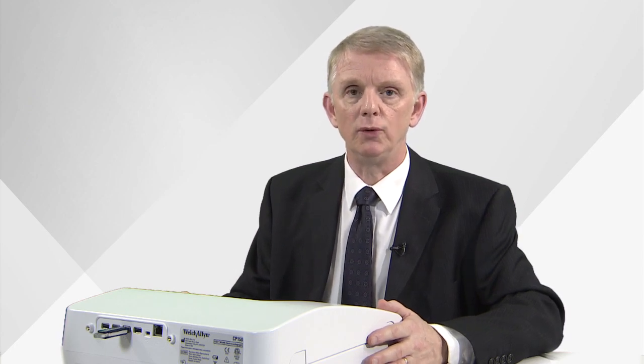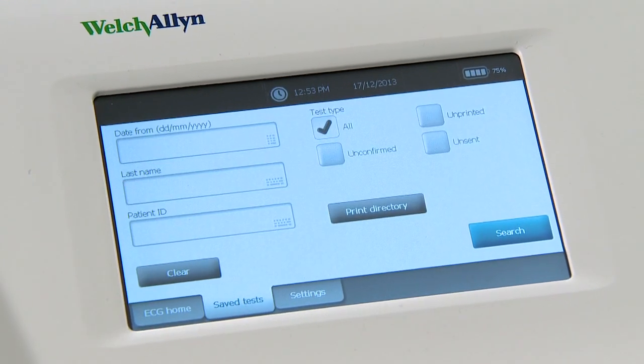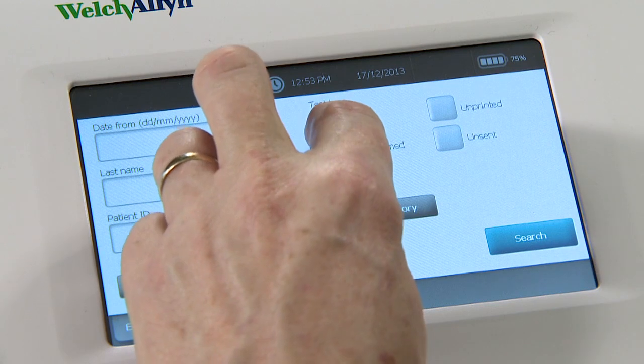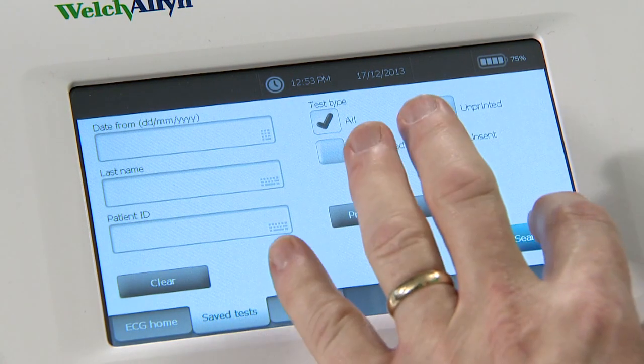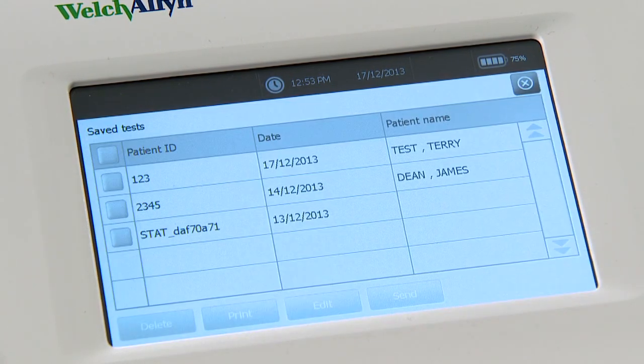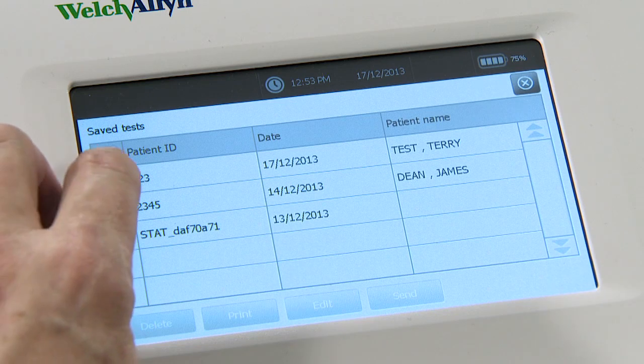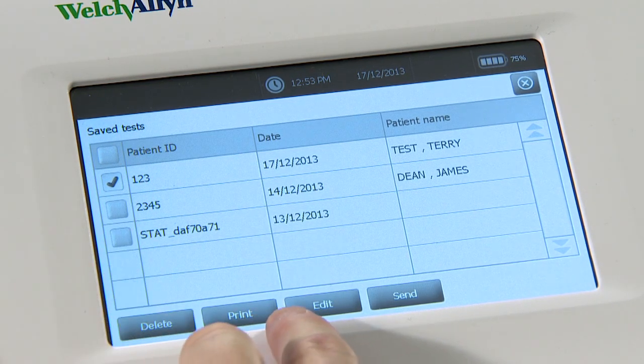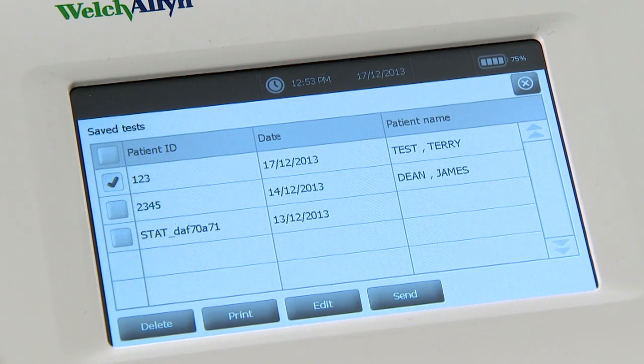If you want to look at tests you've saved to the ECG unit, touch the saved tests button in the home screen and under the heading 'Test Type' put a tick in the box marked 'All'. Press search and the list of patients whose ECGs have been saved in the memory will be displayed. Tick the one you want to look at, and then you can delete, print, or send the ECG to your PC or a mass storage device. You can also edit the patient details.